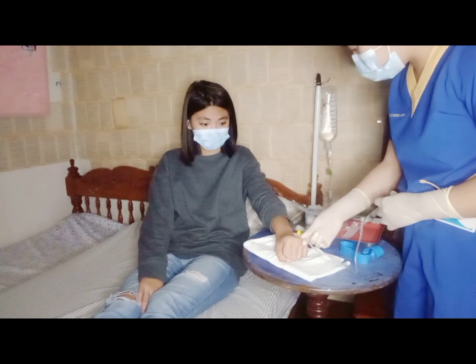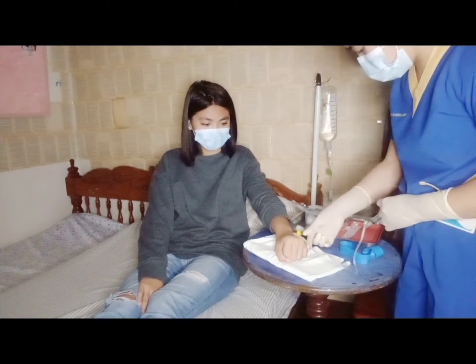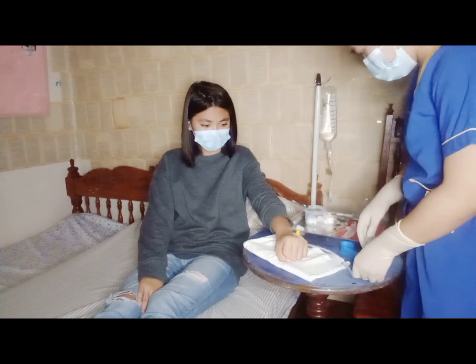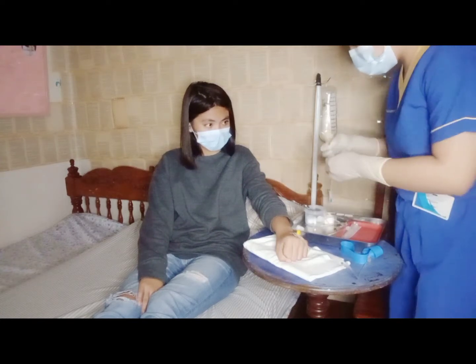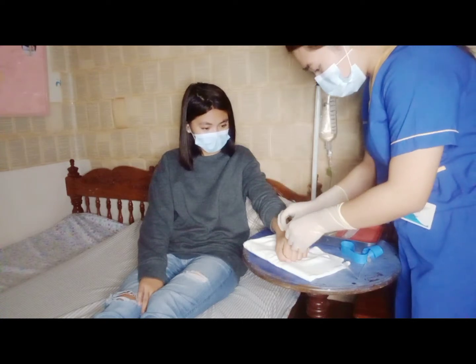So, masakit ba, ma'am, yung kamay ninyo? Hindi po, ma'am. Hindi. Okay, good. Okay. Then we will put on transparent dressing. So, I have no transparent dressing, so I'm gonna use a micropore or a plaster.